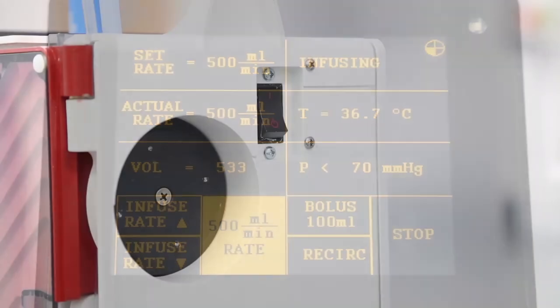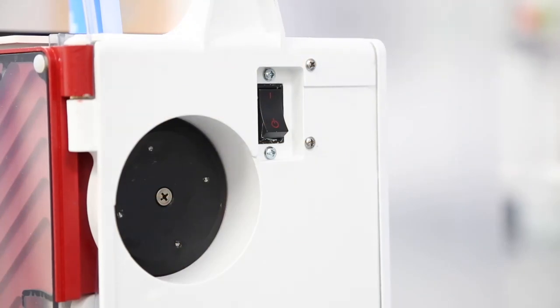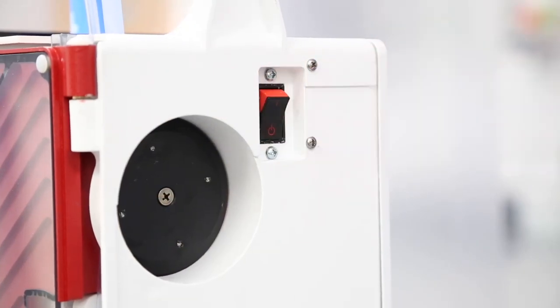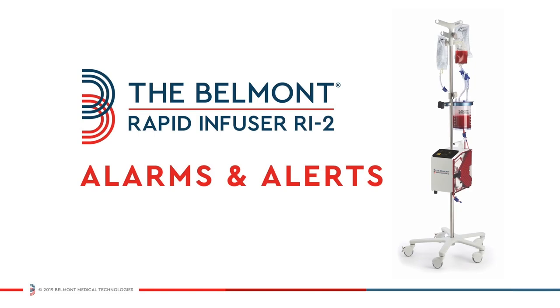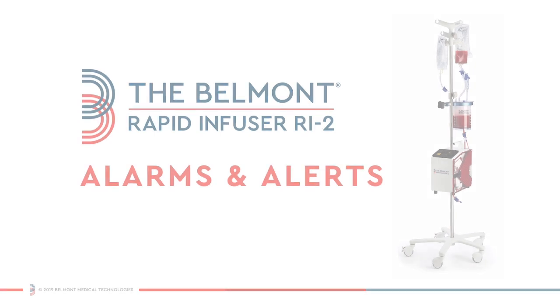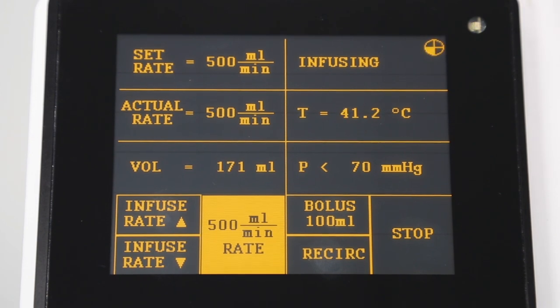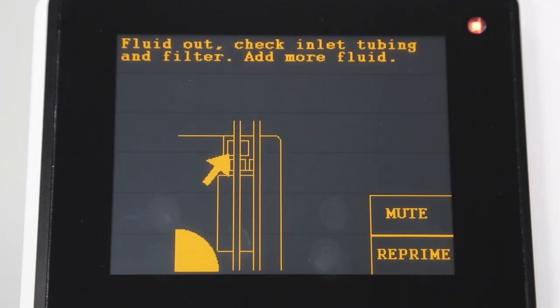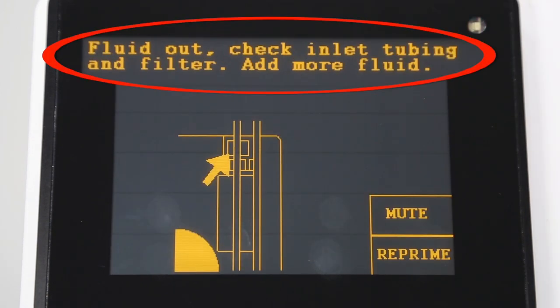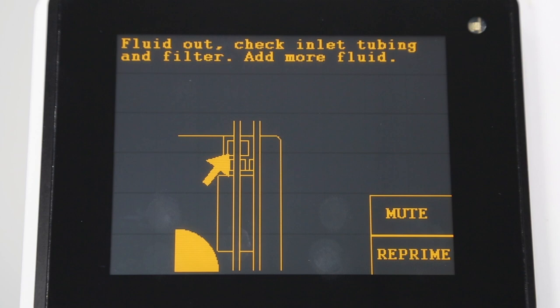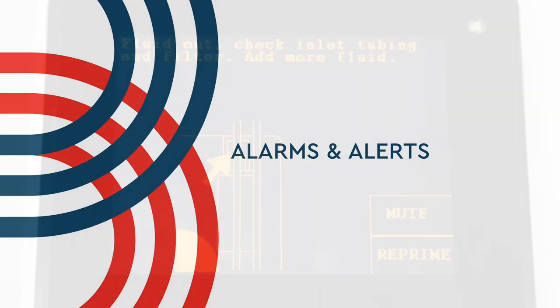At the end of the procedure, be sure to disconnect from the patient and power down by turning off the power switch. The Belmont Rapid Infuser RI2 will alert the user with an audible alarm if it senses a problem and will display instructions for corrected measures. To silence the alarm and return to normal operation, simply follow the instructions on the display. Here are some troubleshooting tips for the alarms you might experience.